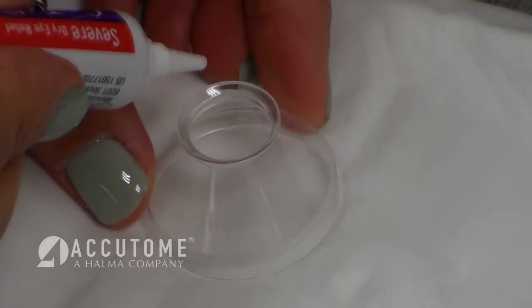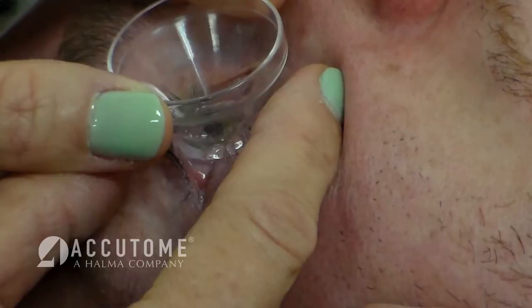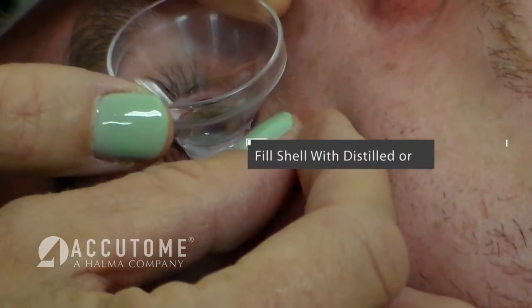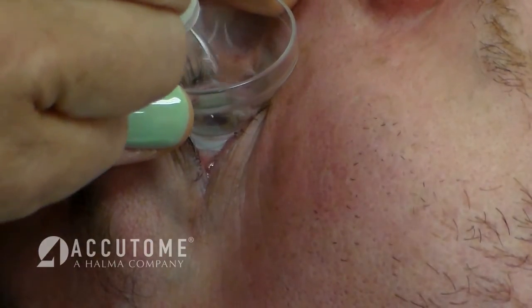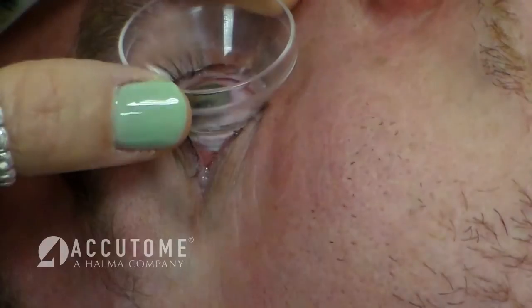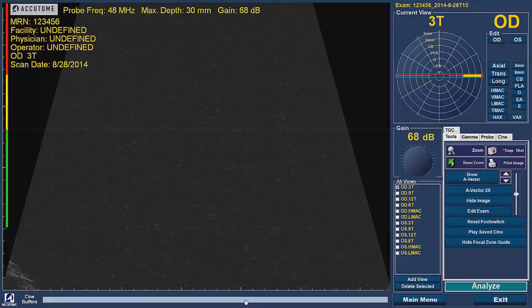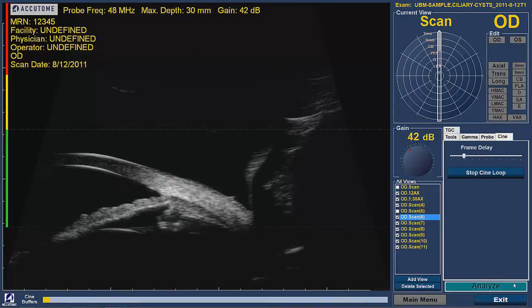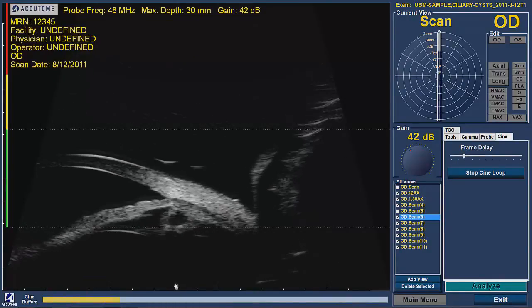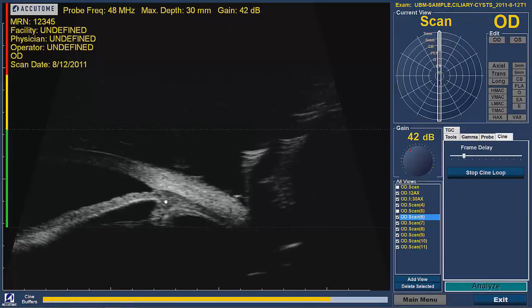Once in scanning mode, place a small amount of Genteel gel on the rim of the immersion shell. Place the shell in the anesthetized eye of the patient and fill the shell with distilled or filtered water. Once the shell is full, turn the probe on by pressing the button or the foot pedal and place the UBM probe into the shell. An image will appear on the screen as soon as the probe is in the water. The image of the patient's eye begins at the bottom of the screen and gradually rises as the probe is placed further into the shell.